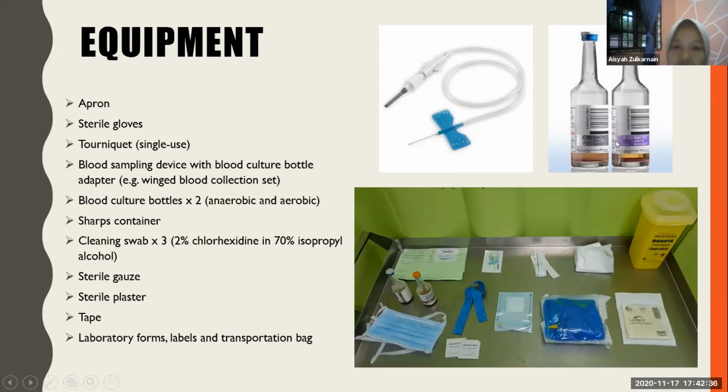In the blood culture procedure, the venipuncture is the same, but the device that is used to collect the blood is different.